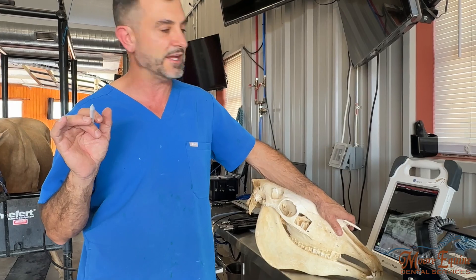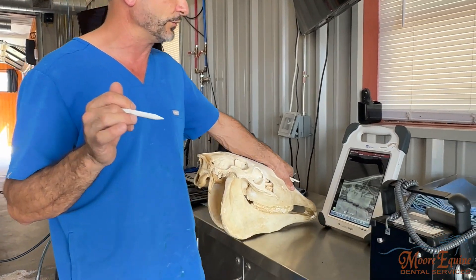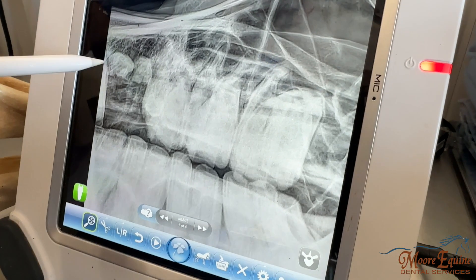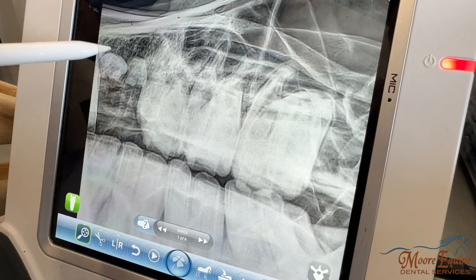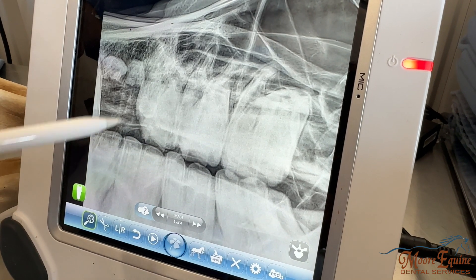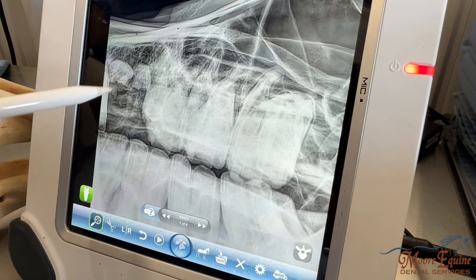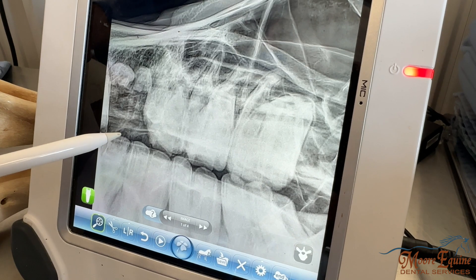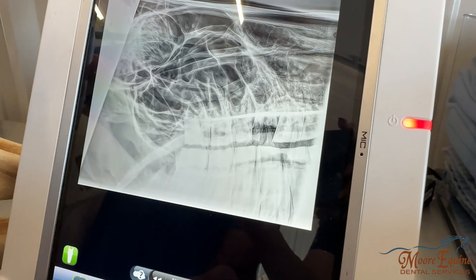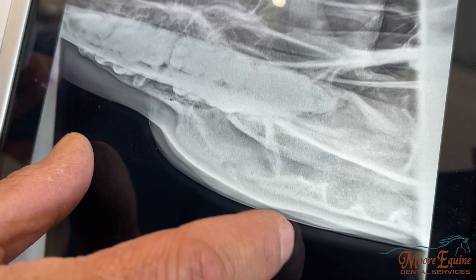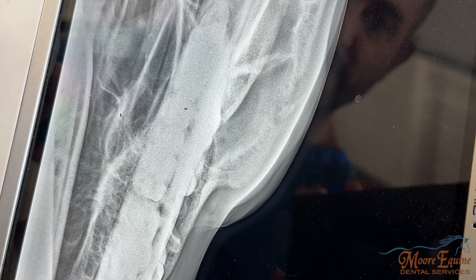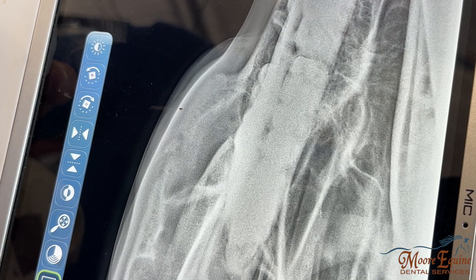I took some radiographs using a little different projection than what we'd typically do. Here we can see the root fragment remnants, but that's not necessarily what I was trying to get the view of — that's why it looks like a slightly odd view. If you have any questions about dental radiographs, we'll post a link — we have several videos showing how to take good equine dental radiographs. Here you can see that again, and here is our region of interest.